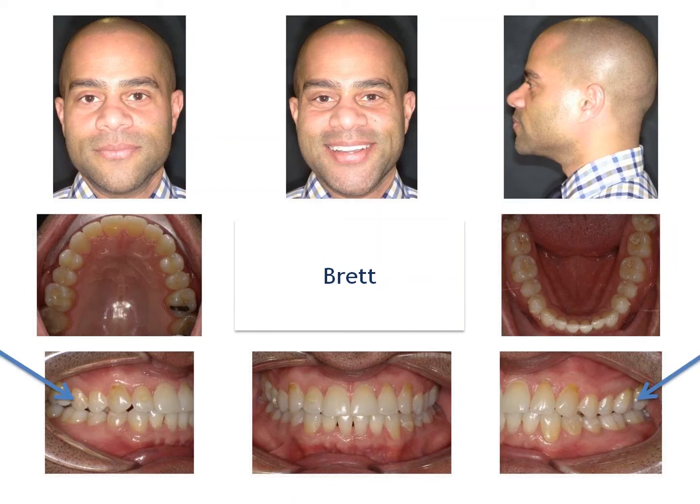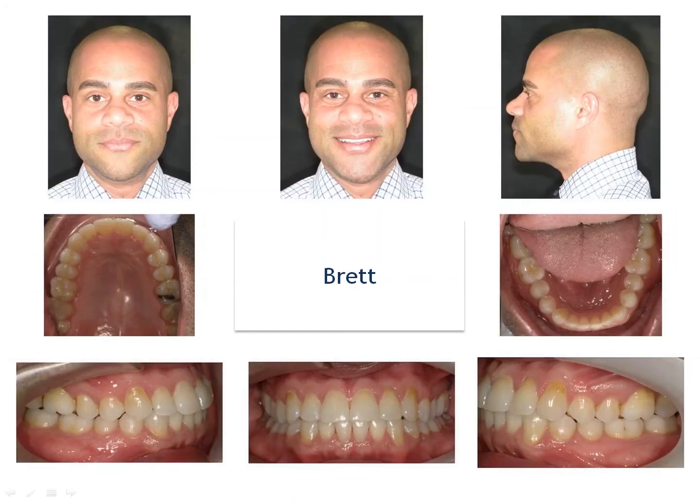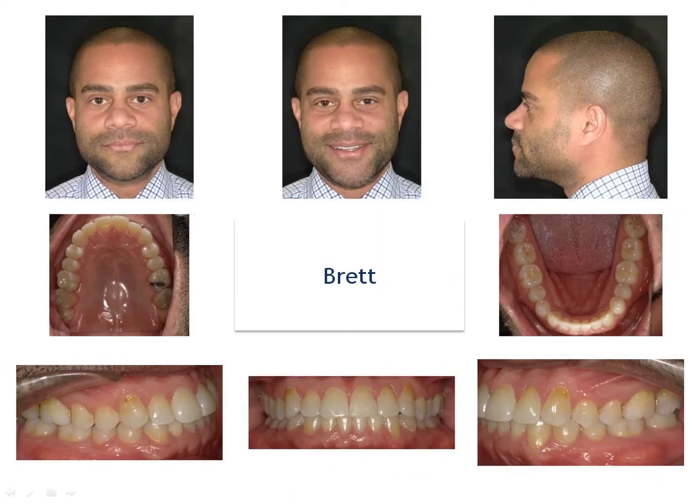high-frequency vibration system, and the bite's still not settled back there. We have too much anterior contact, too much anterior coupling, and there's fremitus. So in order to get that bite settled, we're going to go ahead and do some refinement. We get a little bit better, and the bite's still not closed all the way. The last aligners help to bring him back in a nice solid position.